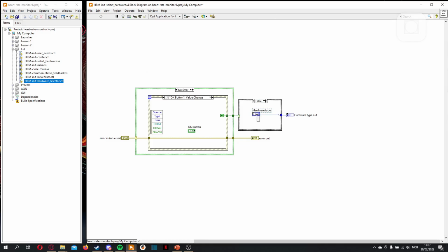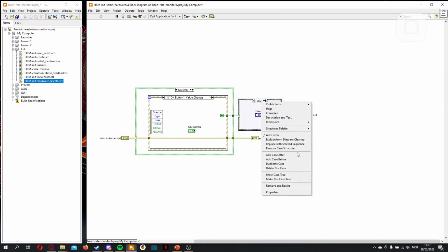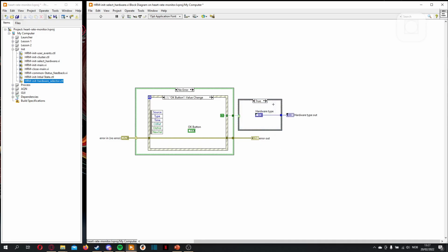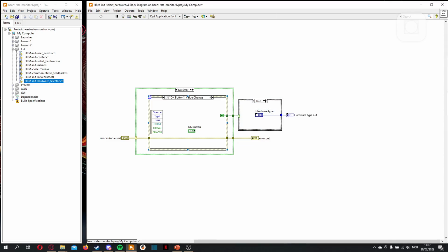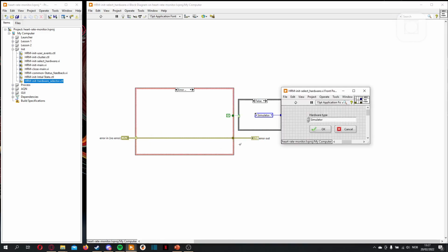Now, as probably a lot of you are screaming at the screen saying I have these wrong, you will be correct. Luckily I caught it here, so make this one true. So when it's true, it reads whatever you have selected here, even if that's simulator. But if you cancel, you cancel with the button, with the panel close, or it just errors, it's false and it goes to simulated mode.